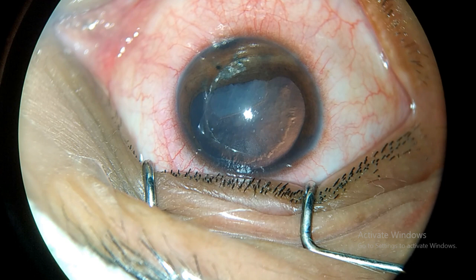The yellow markings in the photo show the area of fibrotic anterior capsule, while the red and white lines denote the iridodialysis and posterior synechiae. The major challenges in this case are the presence of fibrotic anterior capsule and iridodialysis.